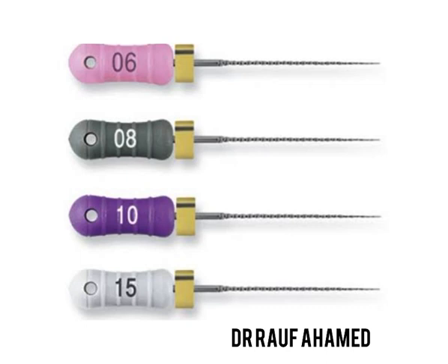Here is a note on the files you should be using when you have difficult calcifications, when you encounter calcific metamorphosis, when you have tight canals, when you have calcified canals. These are the files that you should be using.